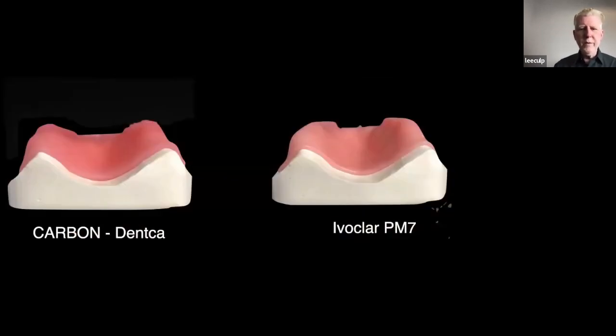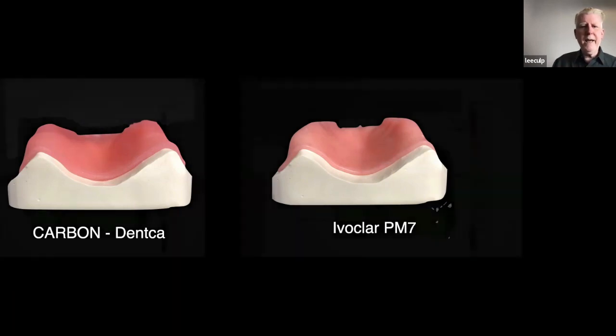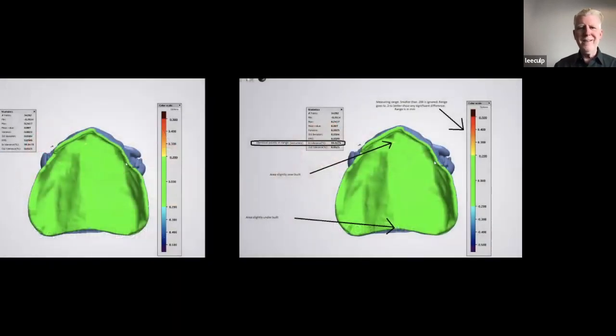So we started doing surface analysis. We started looking at things on our master models. Carbon was the one, because we had one of the first carbon systems out there. It was good, pretty much. And I have nothing against carbon. It's just a really expensive machine. And you can buy basically the same thing for a 20th of the price, with all the new printers coming out.